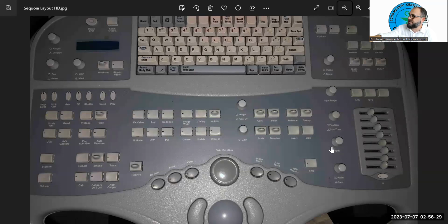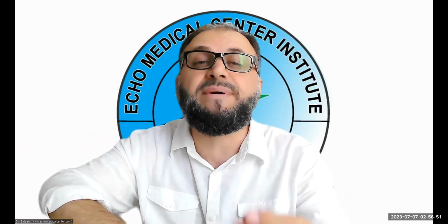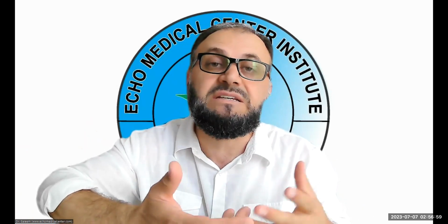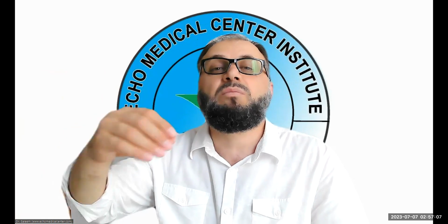So today, I think this much is enough for these knobologies. We covered dynamic range, focal point, depth, 2D gain, and TGCs. Next time, we will talk about the others. It will be a series of knobologies to talk about. I think that helps, because maybe you have a lot of knobs in your machine, very valuable, fantastic, amazing knobs. And that will make your picture perfectly diagnostic. So you can explain your picture easily, and when patients come with any sign or symptom and you scan them, that will give you a perfect diagnosis.